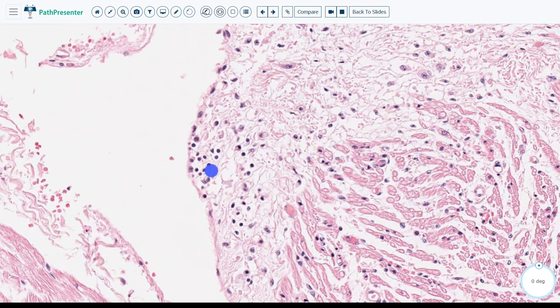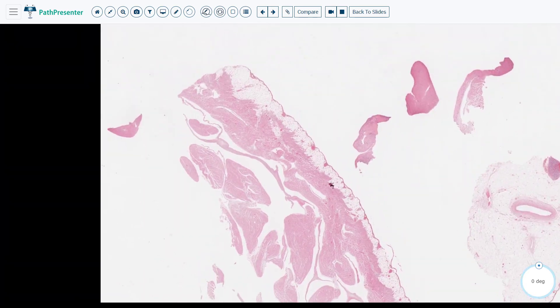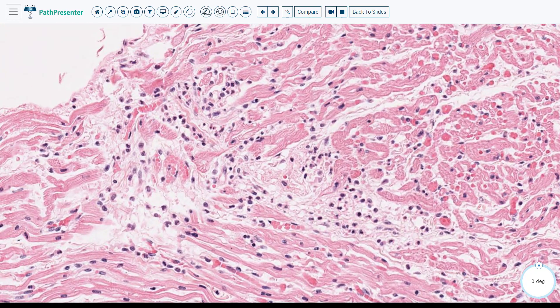These are cross-reactive lymphocytes that were generated during the Group A Streptococcus pharyngitis episode. This area demonstrates numerous lymphocytes in the myocardium, along with some empty spaces that likely represent edema. You have lymphocytes and edema in the myocardium. This inflammation in the myocardium is triggered by antibodies against cardiac myosin. This is a histologic myocarditis.